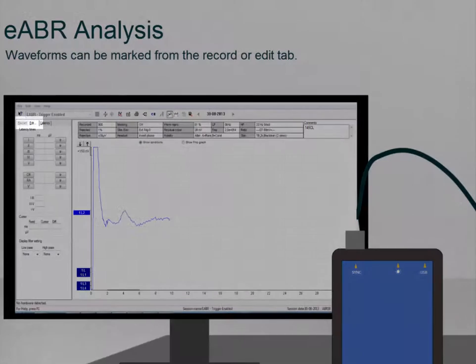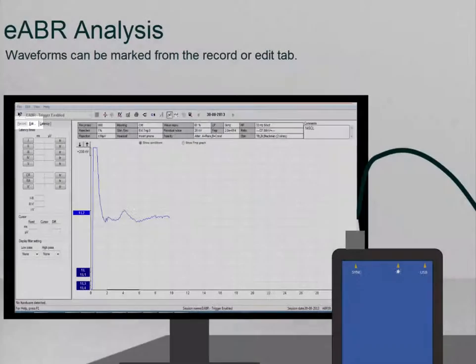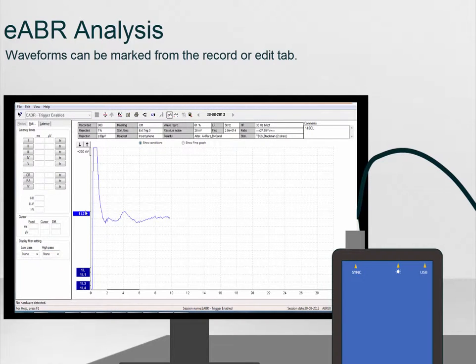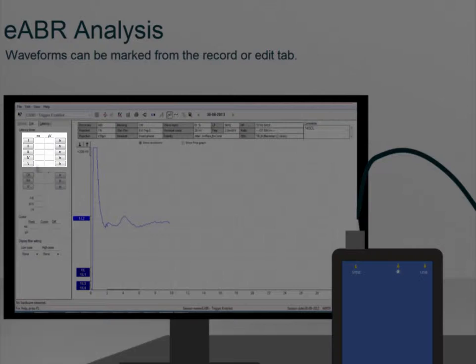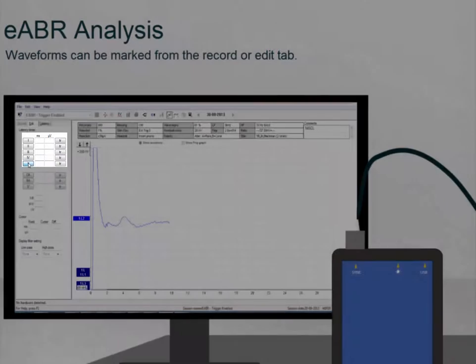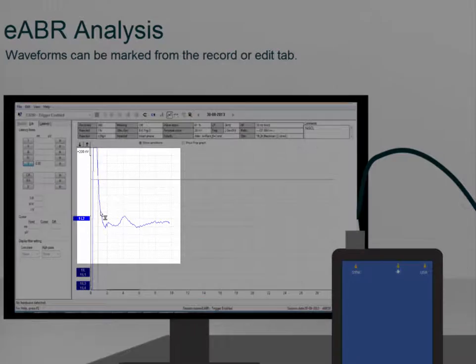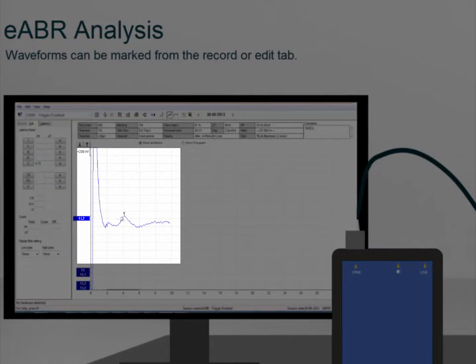Waveforms can be marked from the Record or Edit tab. Ensure you have selected the waveform which you wish to mark. Next, select the waveform marker you wish to plot and then move the mouse over the selected waveform. A left click on the mouse marks the waveform.